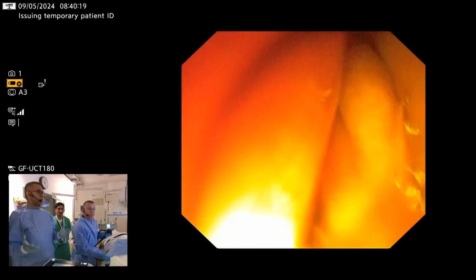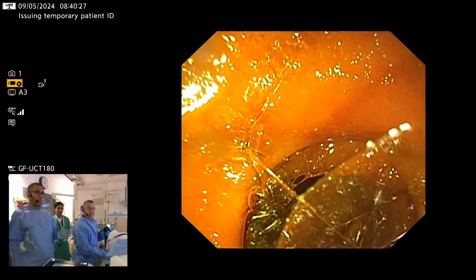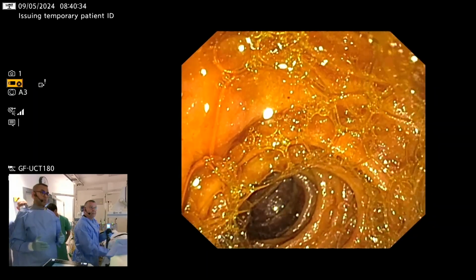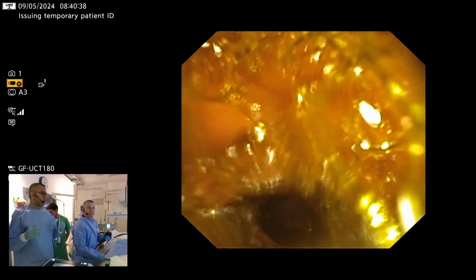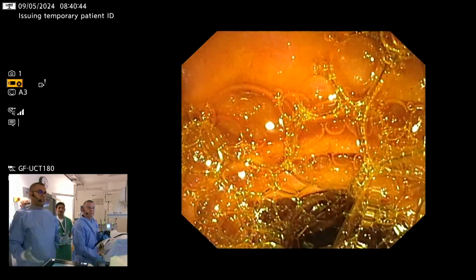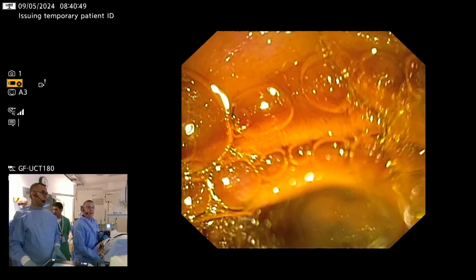So in these patients, you may actually see some sort of elevation of liver enzymes. They may have experienced some sort of abdominal pain. And before all of that, they may have the gallbladder in place. They did not go through cholecystectomy. So that's a beautiful demonstration of a case where EUS is indicated when you have a dilated duct of unknown etiology or the diagnosis hasn't been established. So please keep in mind, you have to look at the patient at 360 degrees, symptoms-wise, lab-wise, imaging-wise, and then you consider doing EUS for that.